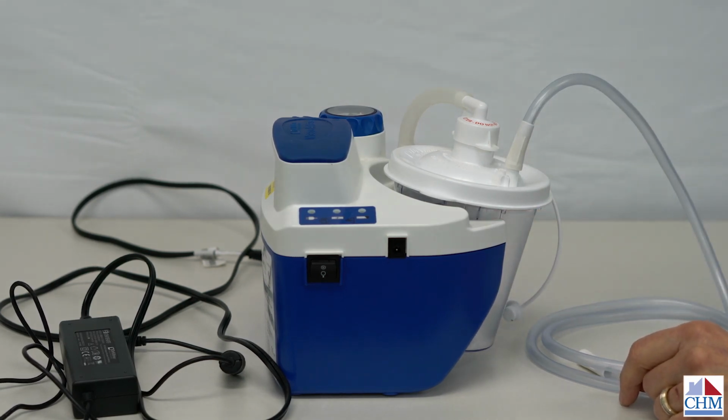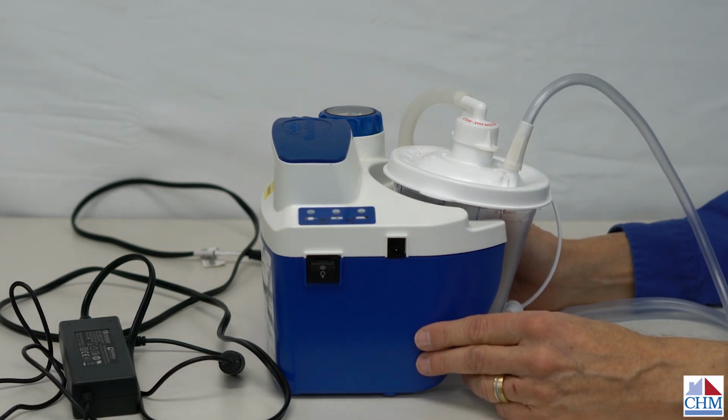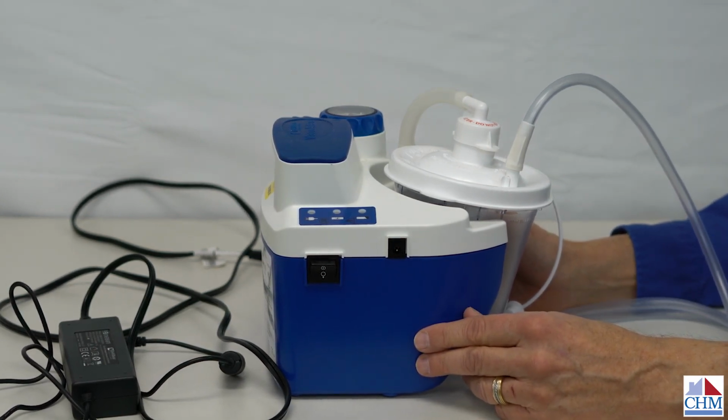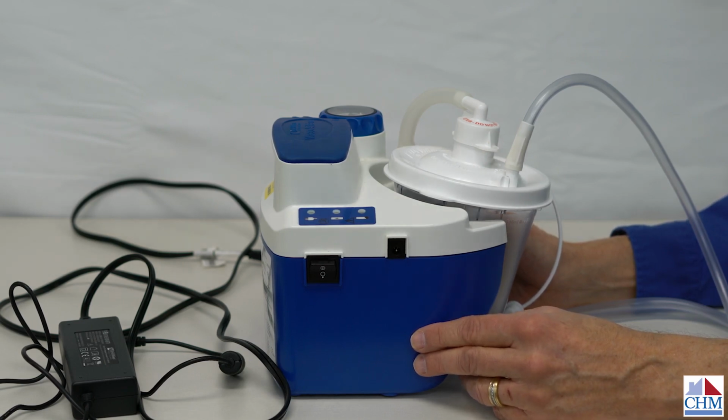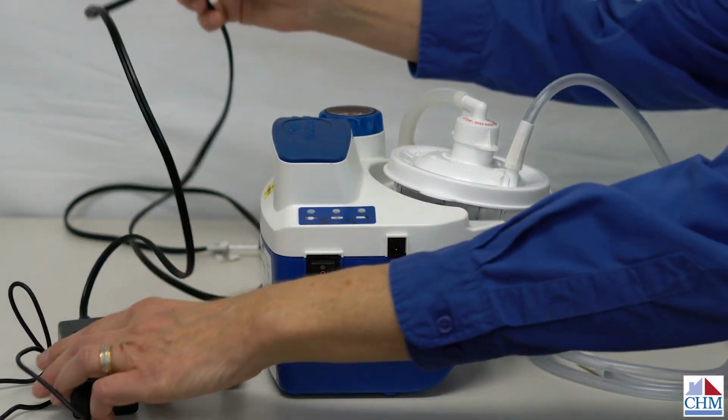Today we're looking at the Devilbiss Vacuaide suction machine. This suction machine is used for both tracheostomy suction and oral suctioning, and it is a battery operated unit. The charging of the battery is done with this inverter.